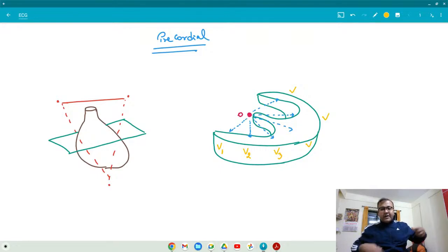Then V5 is at the anterior axillary line, at the fifth intercostal space only. Same level, but it should turn a little bit. And V6 should go along the mid axillary line, same level. So nothing goes beyond the fifth intercostal. Everything is finished between the fourth and fifth intercostal spaces. So 1, 2, then 3, 4, 5, and the mid axillary line is going to be 6.